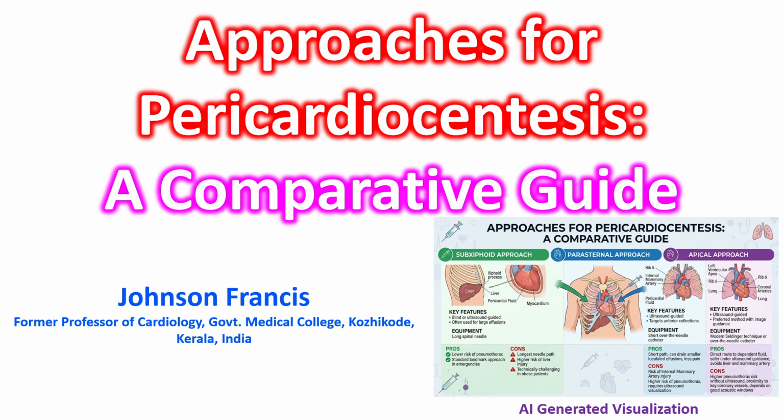While the historical standard was a blind subxiphoid approach, the modern standard of care relies heavily on 2D echocardiography. The paradigm has shifted to a point of maximal fluid strategy. The optimal approach is simply the site where the effusion is largest and closest to the transducer, free of intervening structures. When mapping out the procedure, the three primary access windows each carry distinct anatomical advantages and risks.